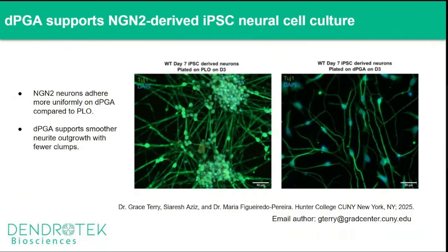Now, here's another example. dPGA supports neurogenin-derived neural cell culture. So in this experiment, the user took iPSC-derived neurons and plated them on PLO or plated them on dPGA. And what we can see is that the NGN2 neurons adhere more uniformly on dPGA compared to PLO. Then it supported a more stable monolayer with fewer clumps. The experiments on this work were done with dPGA after this initial observation.